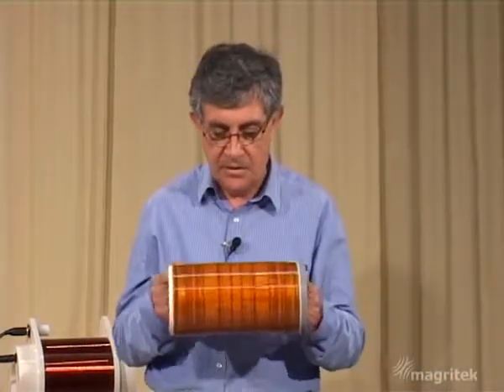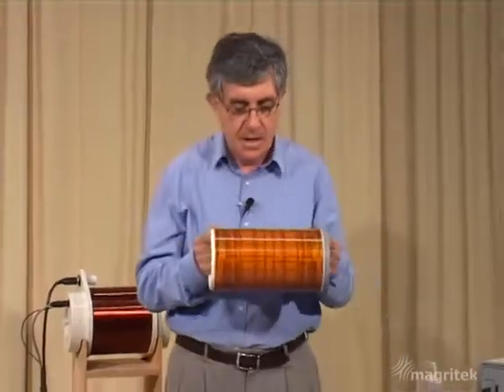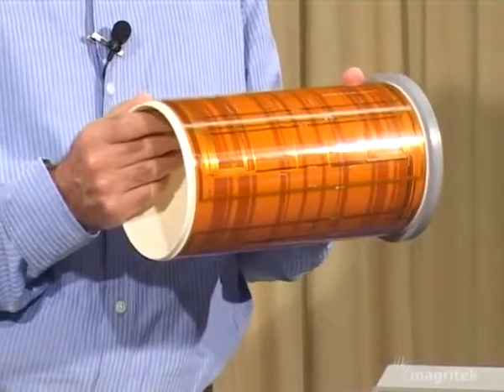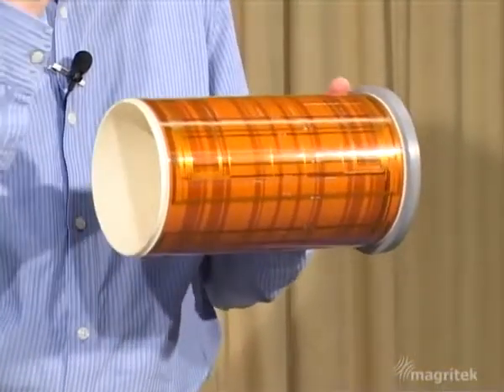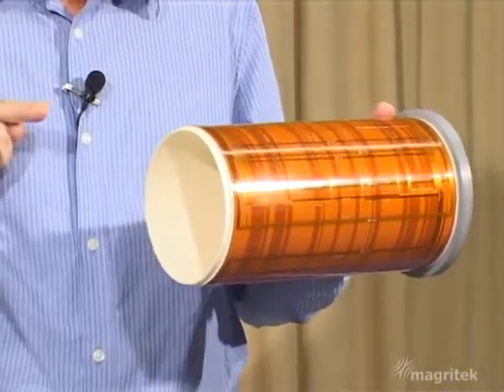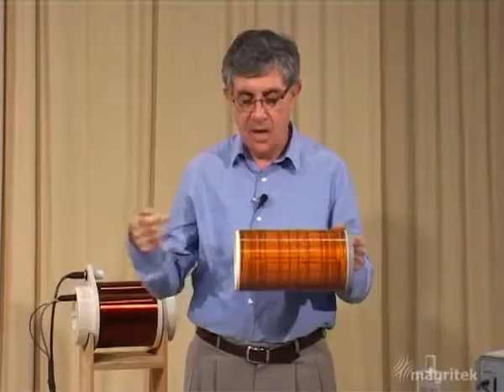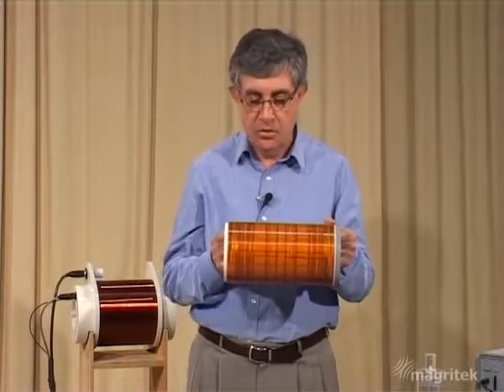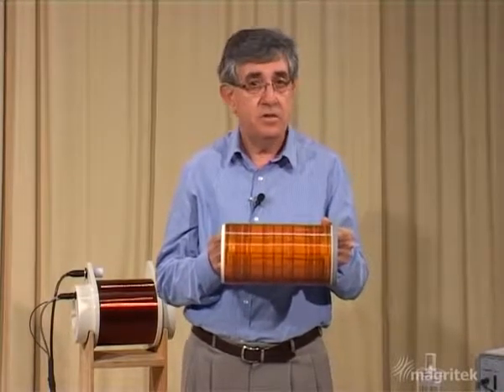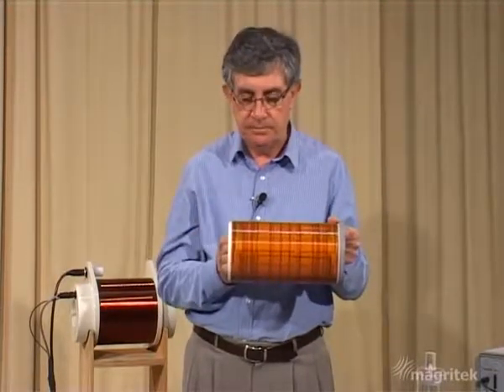Well, we have the gradient coils. These are the coils that are inside the probe of the Terra Nova apparatus. And these coils are able to produce a variation of the magnetic field along each of three orthogonal directions, along the X, Y, and Z direction. In this case, of course, we only need to have a variation of field along the Z axis, where we're going to separate those two tubes of water.